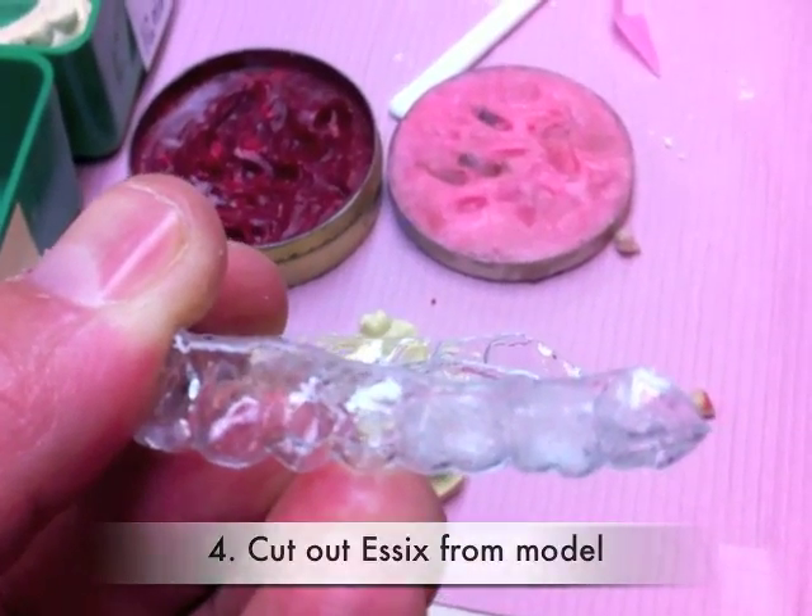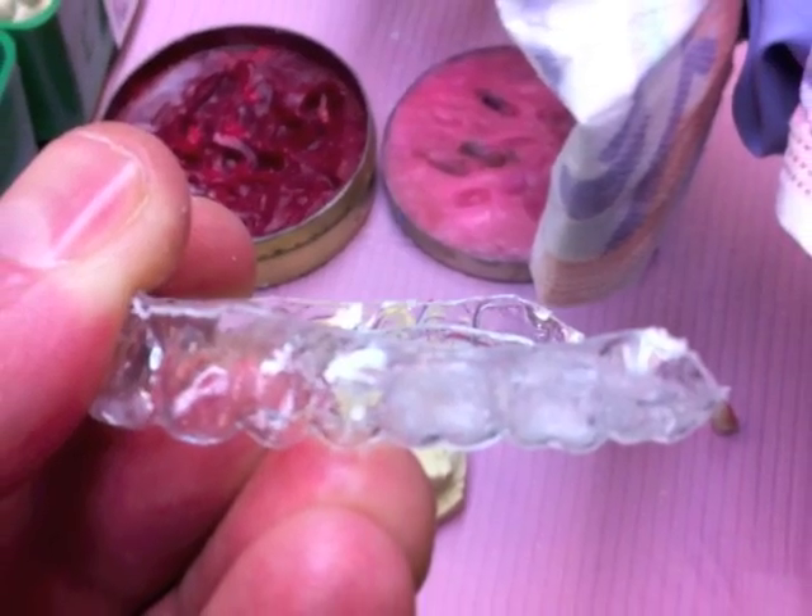Next, you can roughen the inside of the SX where the missing teeth are with a fissure burr.